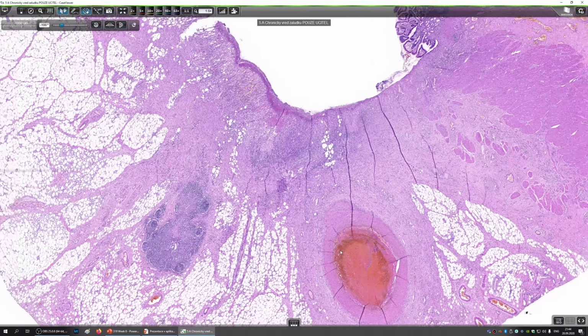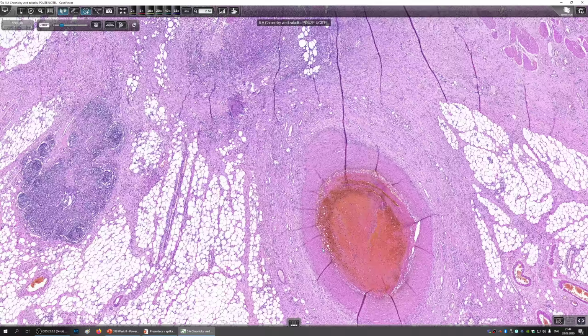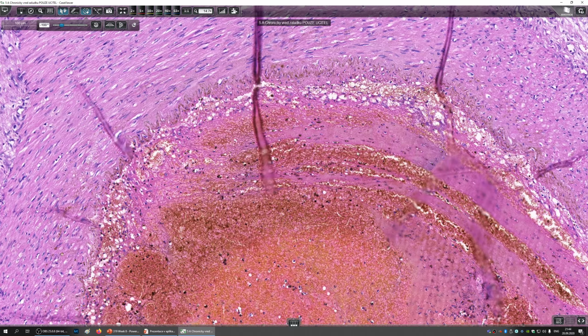And here we see the problem that the patient faced, and there is a huge muscular artery with a fresh thrombus within its lumen. Remember, here's the fibrin mesh which has entrapped a lot of blood, and this patient, if I recall correctly, presented with hematemesis. That means vomiting of fresh blood.